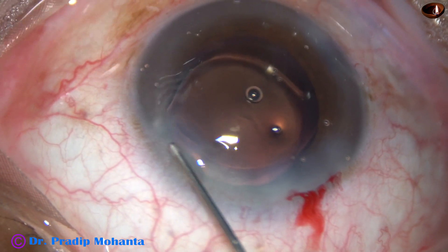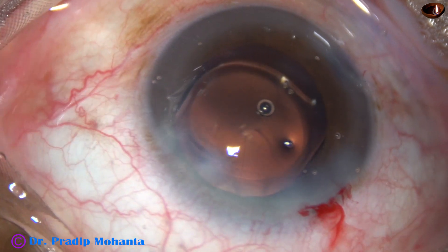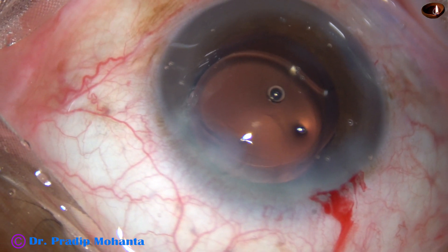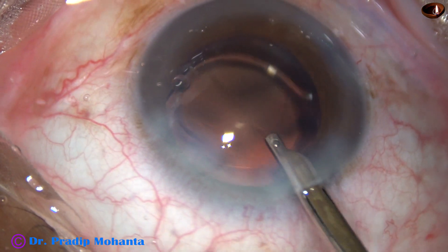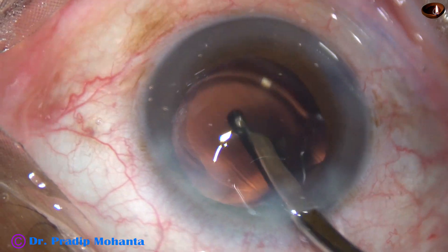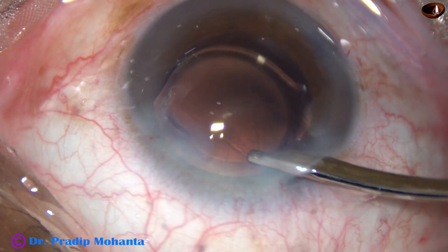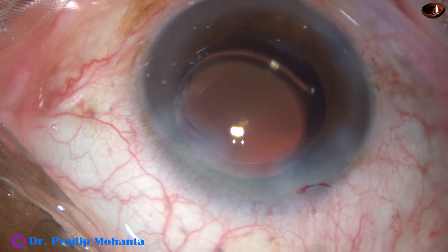The side ports are closed by hydrating the corneal stroma on either side of these stab incisions. A final lavage of the anterior chamber is carried out to remove viscoelastic molecules sticking to the corneal endothelium. The anterior chamber is thoroughly irrigated and aspirated, the anterior chamber is formed nicely, and the case is concluded.